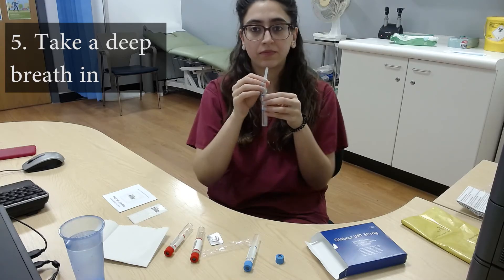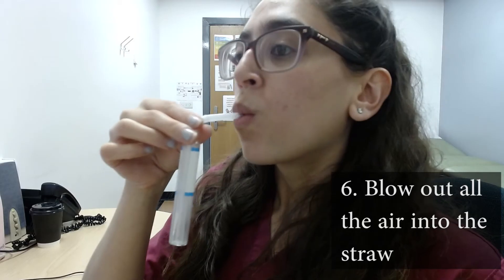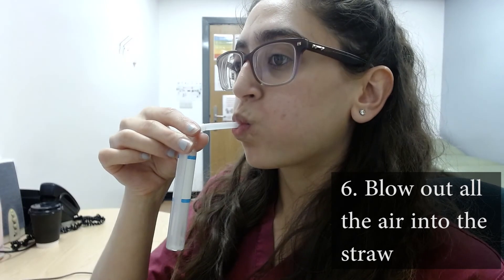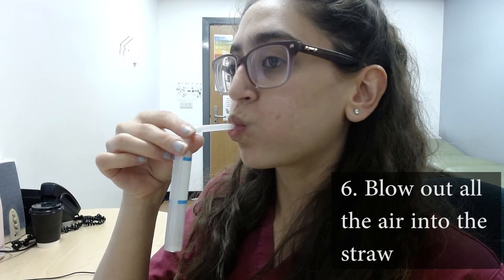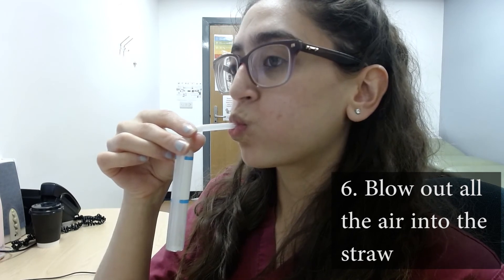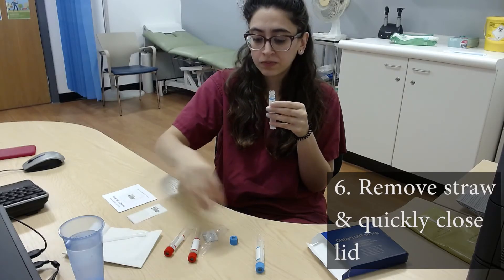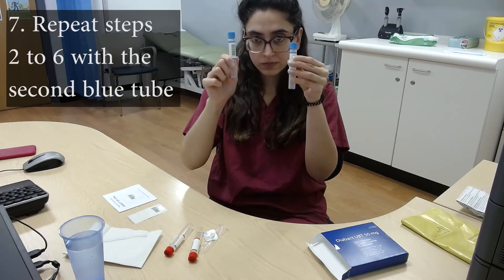Take a deep breath in. Take the straw into your mouth and blow out all of your air into the tube. You should keep blowing until you cannot blow out any more air. When you feel as though you cannot blow out any more air, remove the straw and quickly screw the top back on the tube. Repeat steps 2 to 6 to fill the second blue tube.